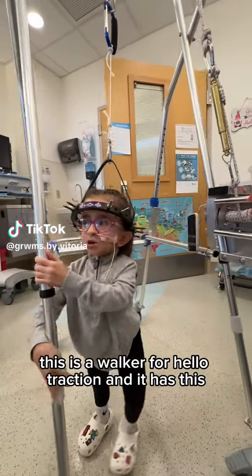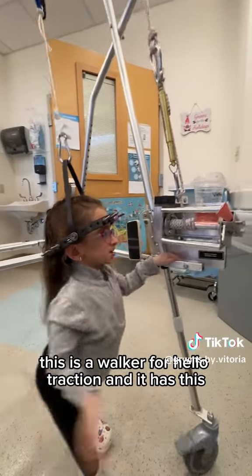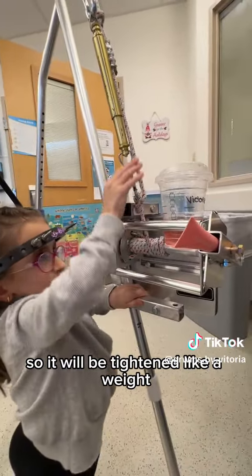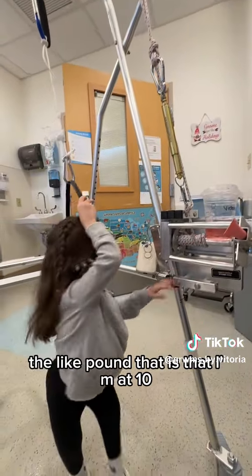This is a halo walker for halo traction. It will be tightened like a weight — this shows the pounds. I'm at 10 pounds right now.